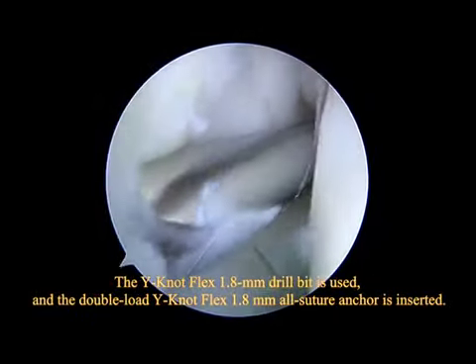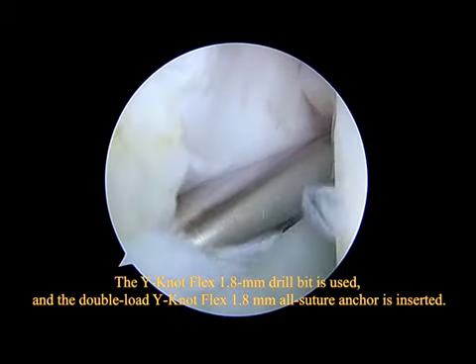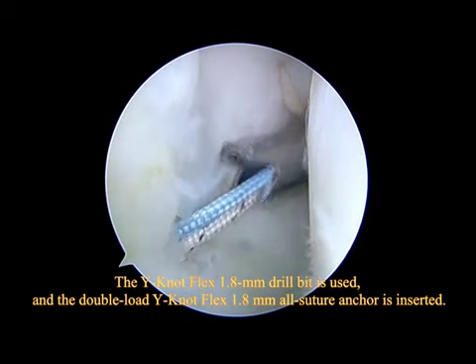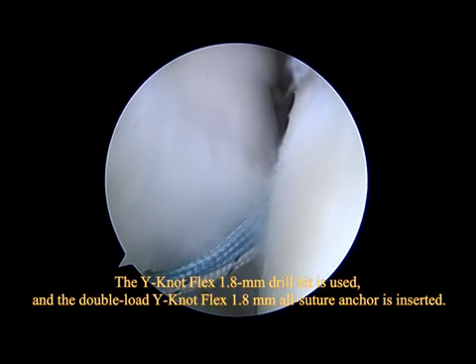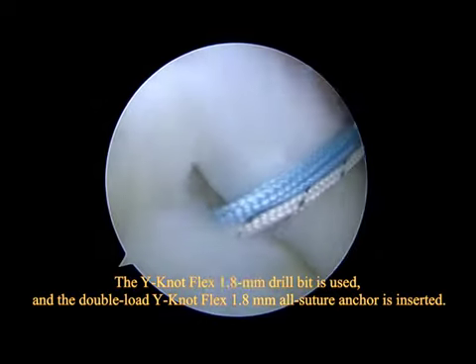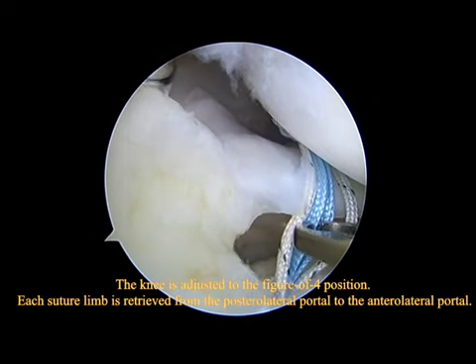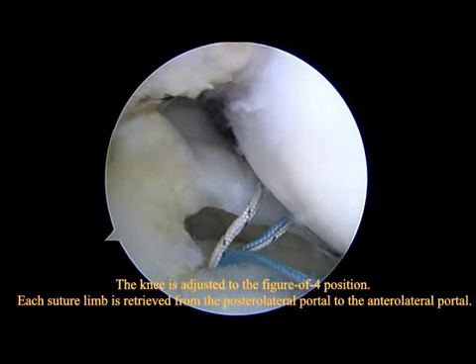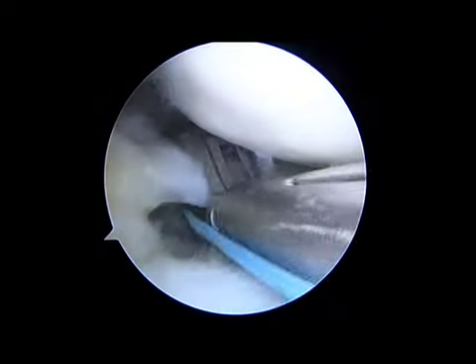The Y-Knot Flex 1.8 mm drill bit is used, and the double-load Y-Knot Flex 1.8 mm all-suture anchor is inserted. The knee is adjusted to the figure of 4 position. Each suture limb is retrieved from the posterolateral portal to the anterolateral portal.